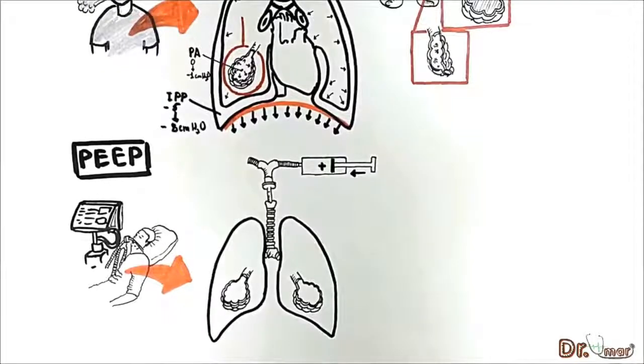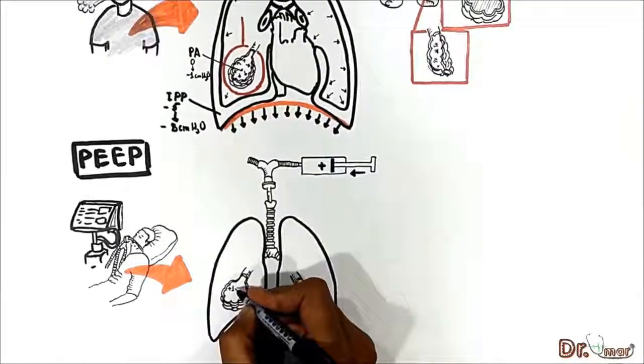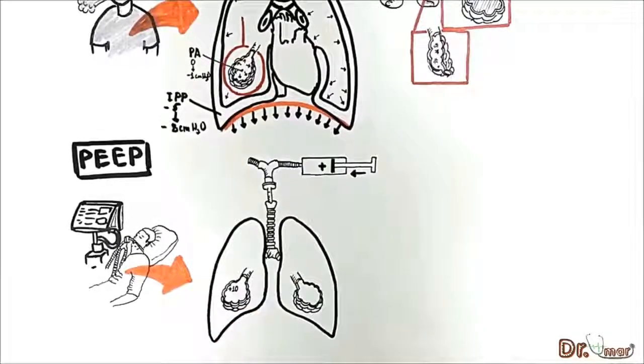Pumping air into the lung makes the pressure in alveoli more and more positive. It is at its most positive at the end of inspiration. Suppose the alveolar pressure becomes +10 cm water. This pressure reinflates most of the collapsed alveoli.